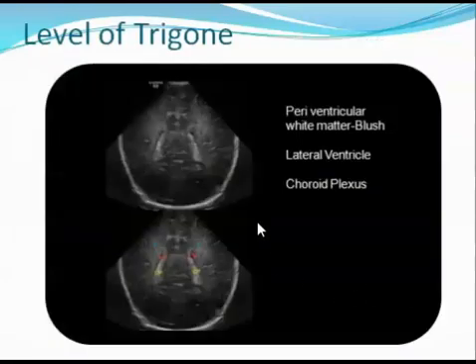Sometimes the white matter around the lateral ventricles appears quite isodense. It appears a little bit more prominent. If we look over here, this is called the periventricular white matter or periventricular blush. Look at the symmetry and the density of this white matter. It should not be more dense than the choroid plexus, which means it should be less bright than the choroid plexus. So when you see this periventricular blush, pay a little more careful evaluation of this area.